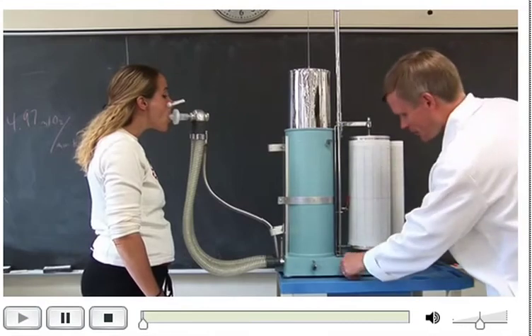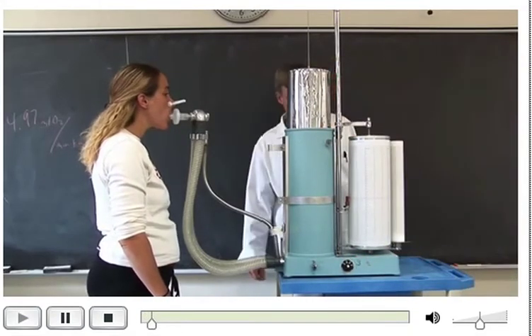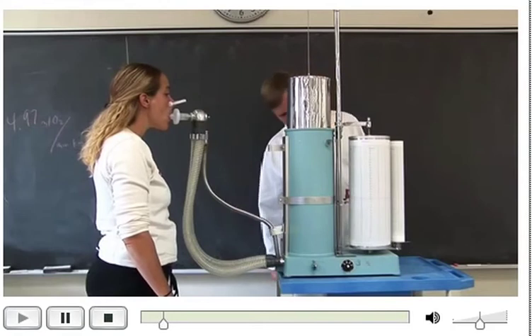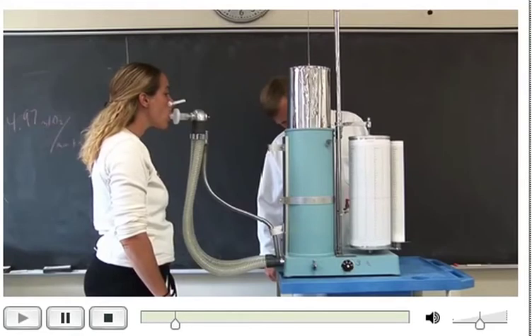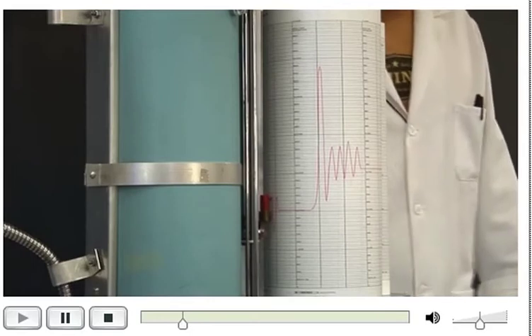All right, let's turn on that. Go ahead and breathe. So right now, our subject is breathing to the room, breathing normally. Now the subject is breathing into the spirometer, the classic water-filled spirometer, breathing normal tidal volumes. We'll take one more tidal volume.